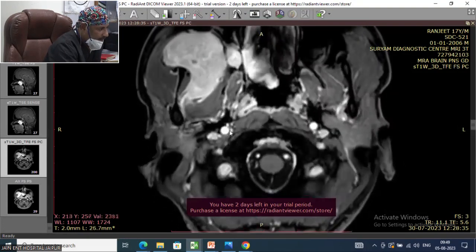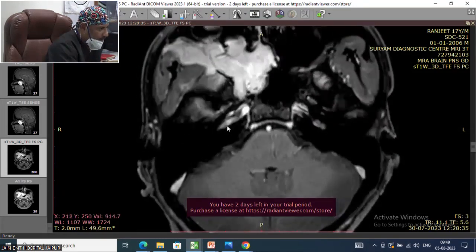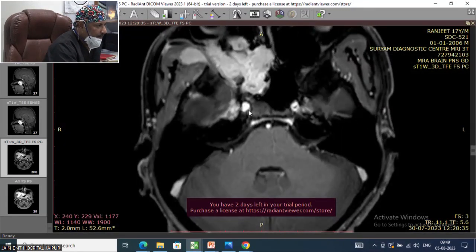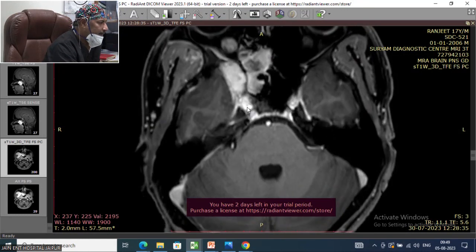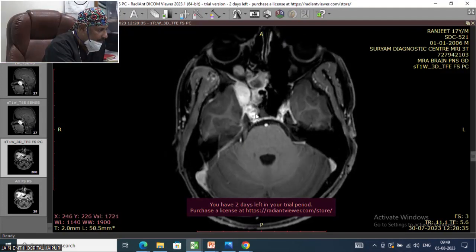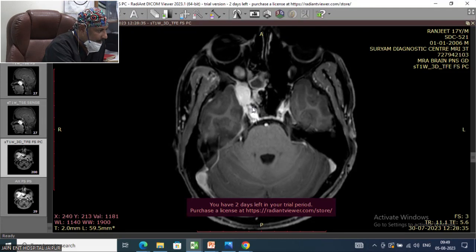Now going up, this is the horizontal petrous carotid. Very clear? And this tumor is coming from the orbital fissure. See this? This is the entire superior orbital fissure, which is involved by the tumor. And from here, going anteriorly through the superior orbital fissure, it grows toward the cavernous sinus. That's the cavernous carotid. And see this, there is periosteum all around the tumor.